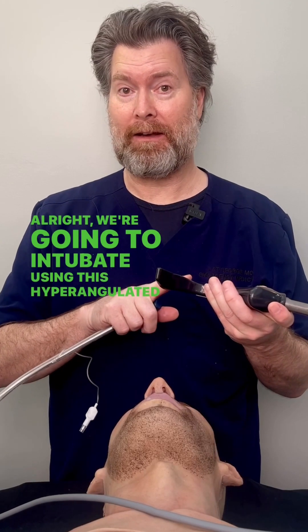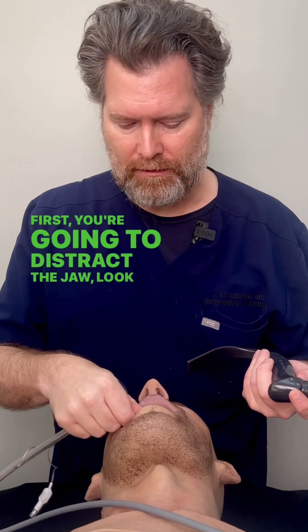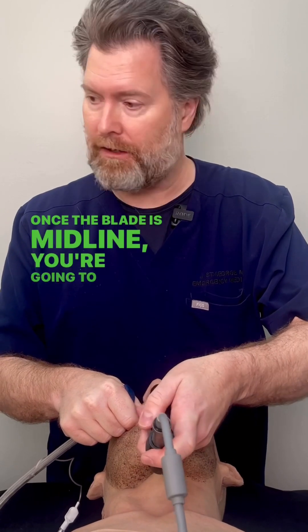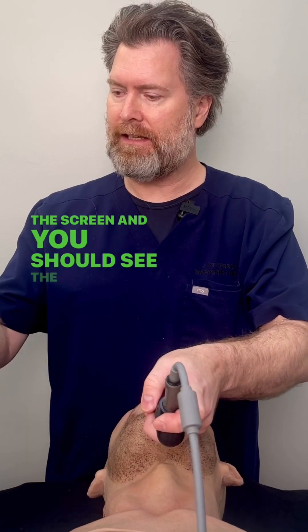We're going to intubate using this hyper-angulated blade and a rigid stylet. First you're going to distract the jaw, look in the mouth, and place the blade midline. Once the blade is midline, you're going to look back up at the screen and you should see the uvula.